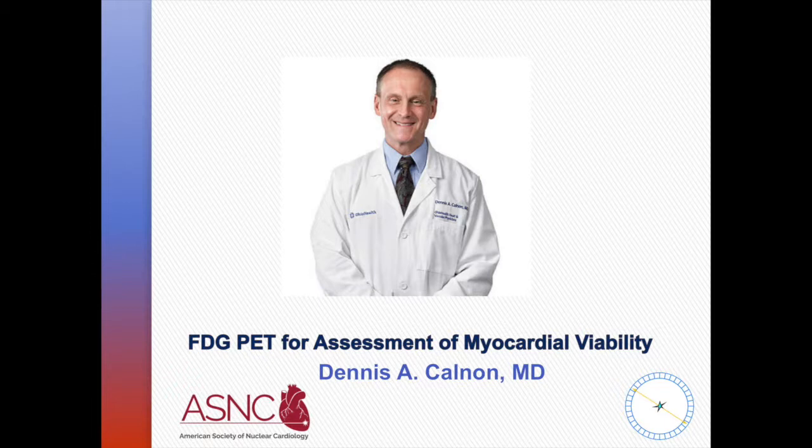We prefer to do the ischemic evaluation with PET if possible, just because then the FDG images would be more closely matched with the perfusion assessment, because both images would be performed with PET and would be attenuation corrected in a similar manner. So we prefer PET if possible, but you can certainly use the SPECT, technetium-labeled SPECT tracers and perform ischemia assessment in that way, and then decide on using FDG only if there is absence of severe inducible ischemia by SPECT.